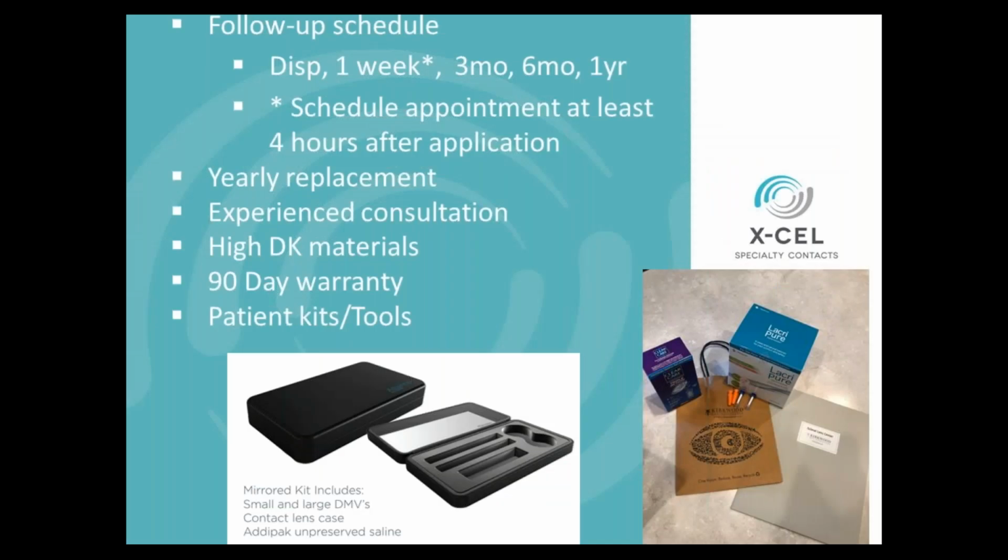So the follow-up schedule, this depends on you. I always leave this up to the practitioner. This is just recommended with sclerals. If we're talking about a challenged cornea, we like to see these patients. We dispense, obviously. I say 1 week because everything that's going to happen with that scleral will happen in a week. Some practitioners like 2 weeks. And then here, depending on the patient, this is more of a cone patient follow-up. Some doctors like to see the patient at 1 month.